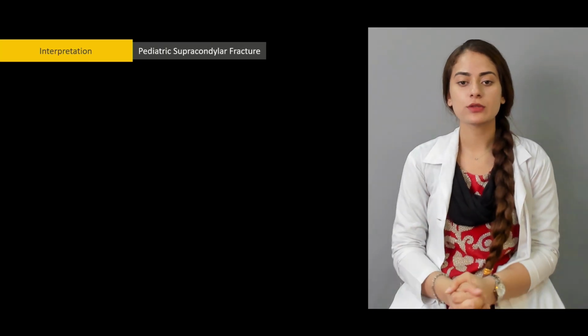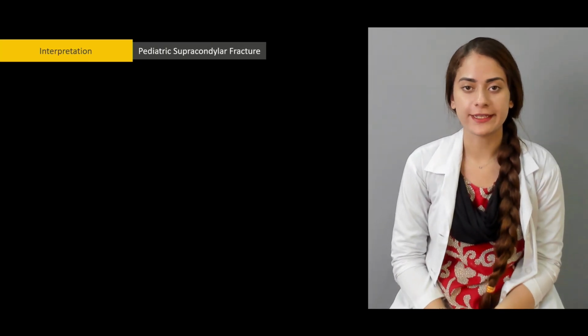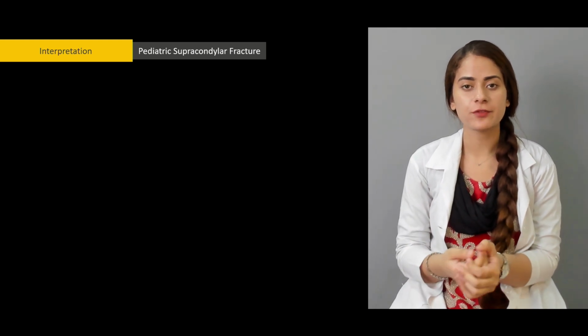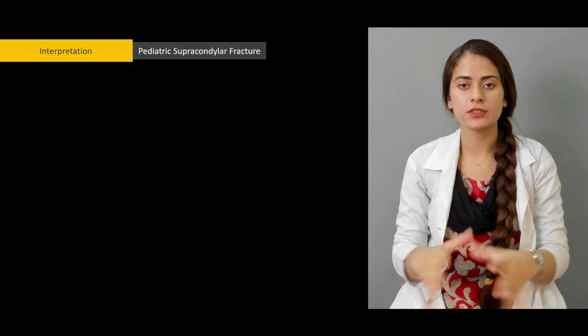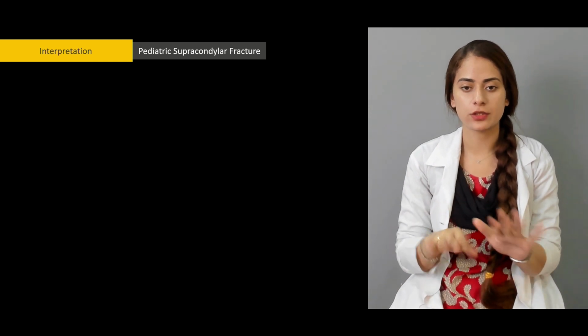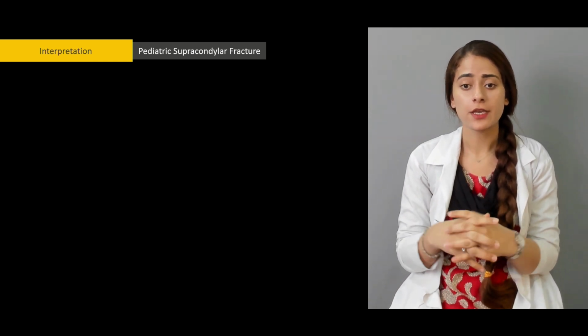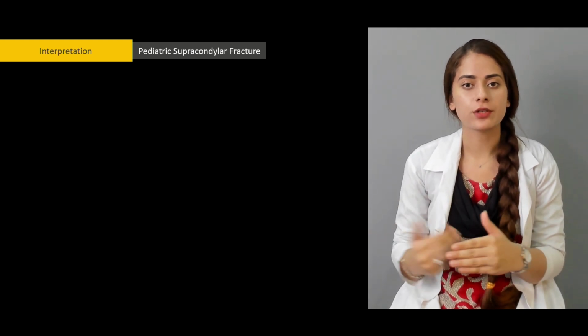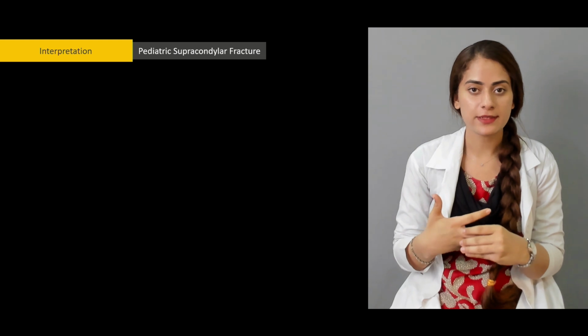So now we're going to talk about pediatric supracondylar fracture. Before going into the radiographs, let's take a little bit of time to discuss some things. We will talk later on as well about the fat pads.